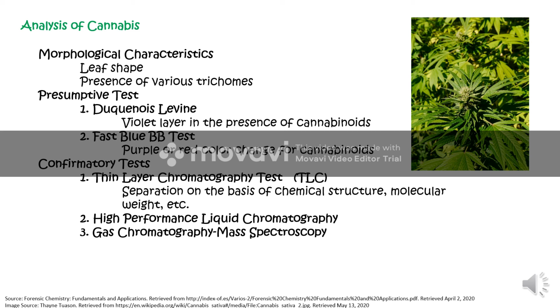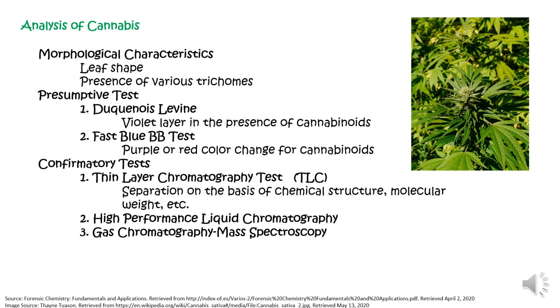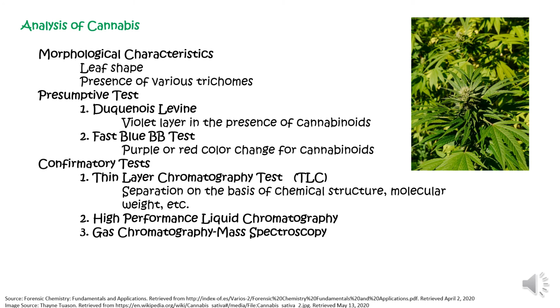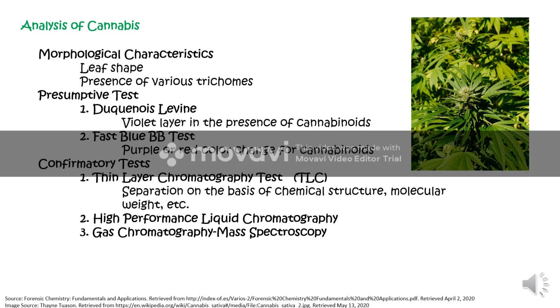Aside from TLC, we also have high performance liquid chromatography, GC and GCMS, which may also be used as confirmatory analysis. So HPLC and GCMS, or gas chromatography mass spectrometry. However, in many cases, presumptive tests like the ones mentioned and TLC are already deemed sufficient for court purposes.